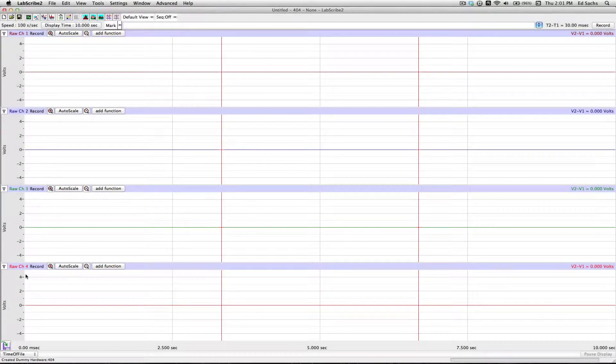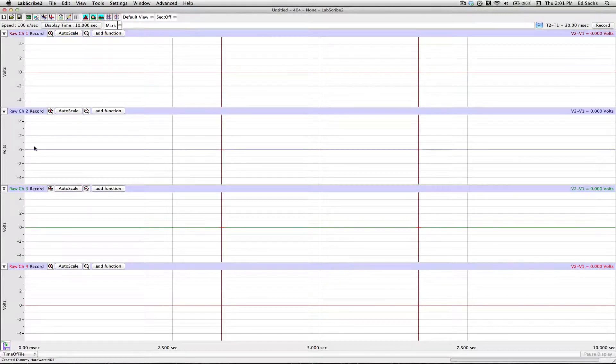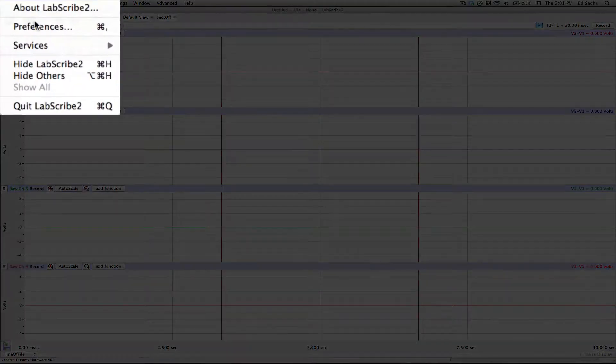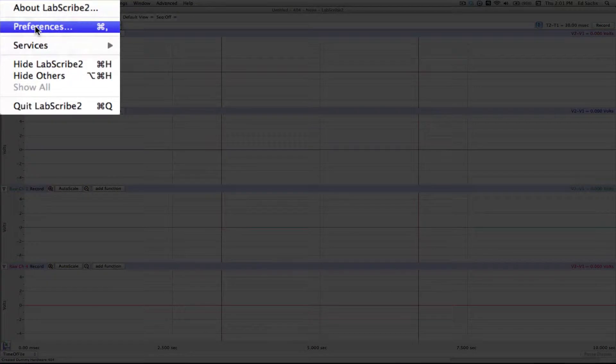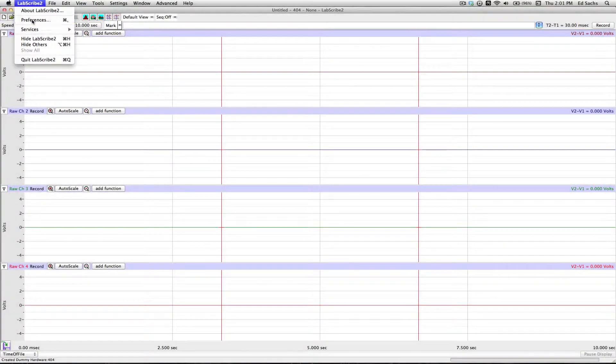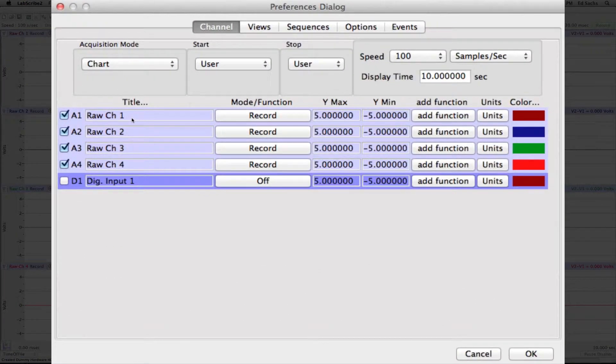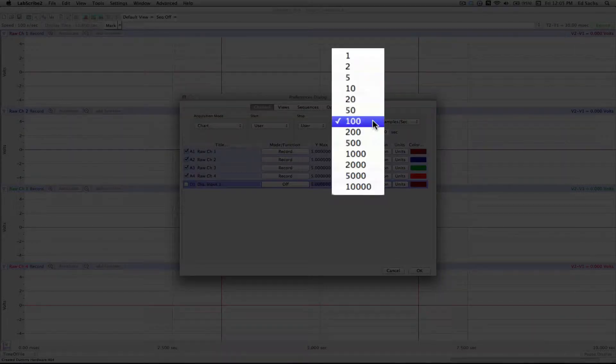To set up the protocol, let's change the display settings. Go to LabScribe, Preferences (on a PC that would be Edit Preferences). And in the setup box, first we'll change the speed to 1,000 samples a second.